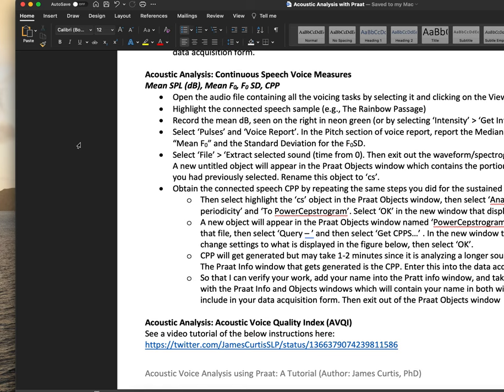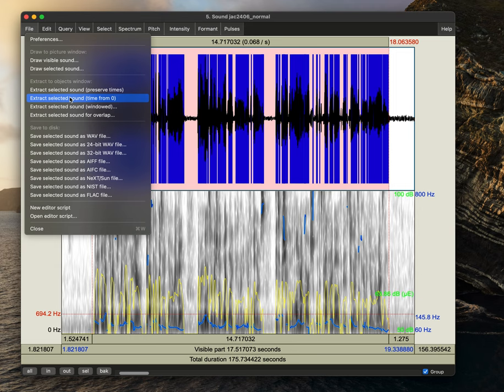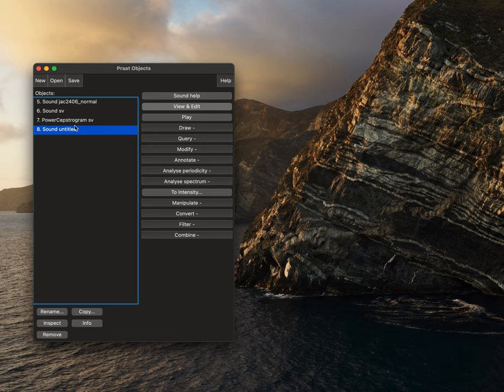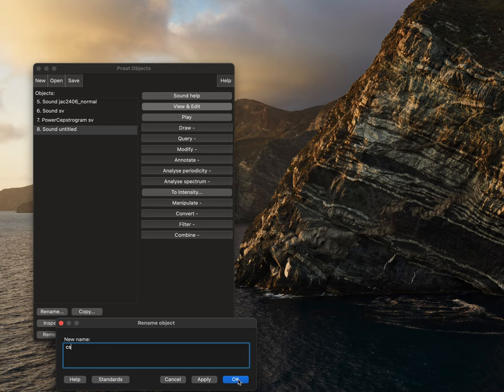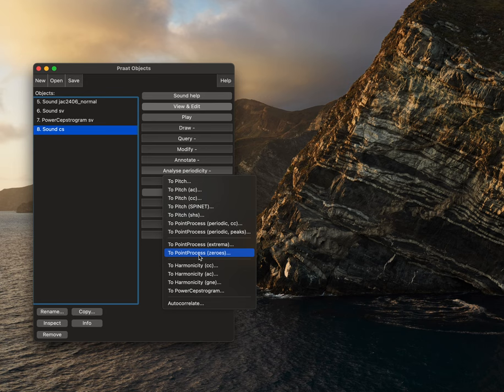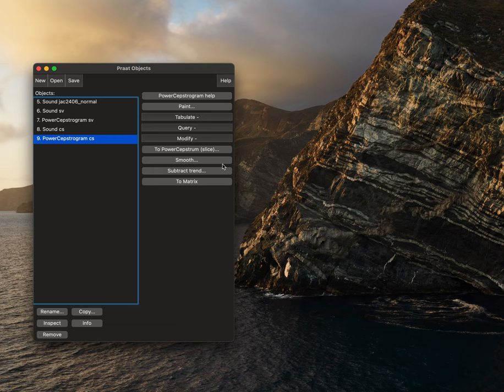The last one we want to get for connected speech is a cepstral peak prominence for speech. So to do this, just as we did before, we'll go to file, extract selected sound from time zero. We'll then exit out of this and we have our new sound untitled file. This is what we just extracted. And to verify that we could always push play to verify. So we'll rename this and now we're going to rename it to CS for connected speech. We'll select OK.